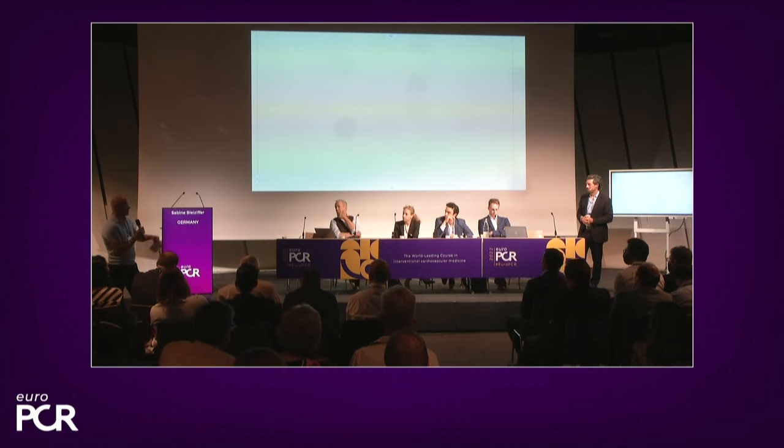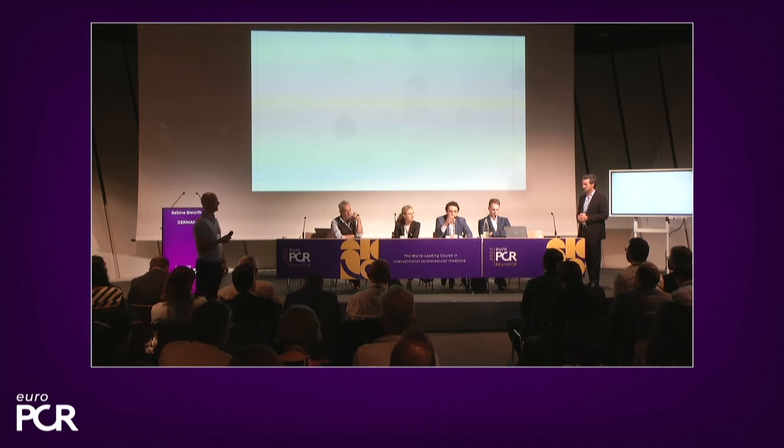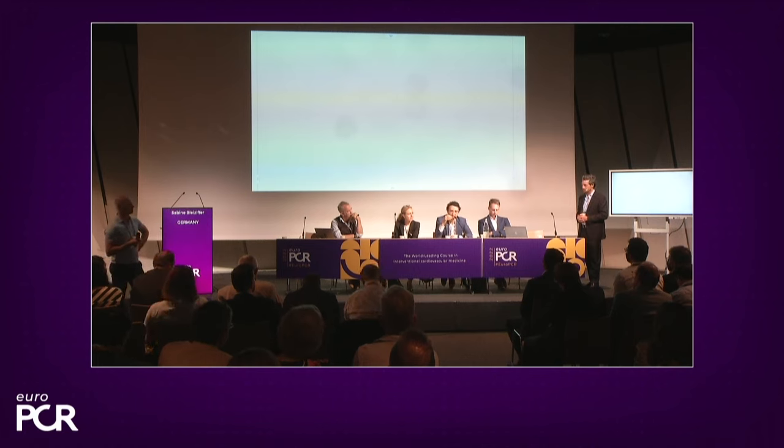Yeah. Just one quick comment, very quick, I promise. I think what Nico said, the fact that you elongate the LVOT, made operators very comfortable with this technique, and also the amount of investment in education for people. I think the advantage of cusp overlap is that it's very much reproducible, because in the beginning I would do X, Nico would do Z, people would do different things.